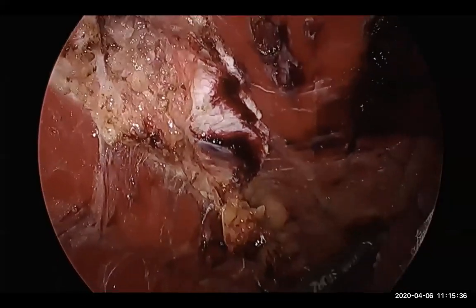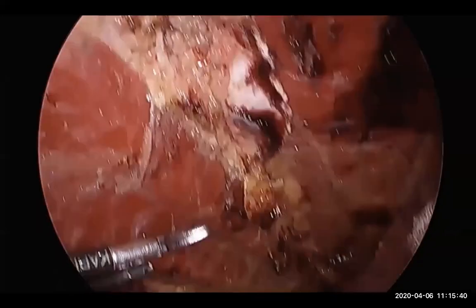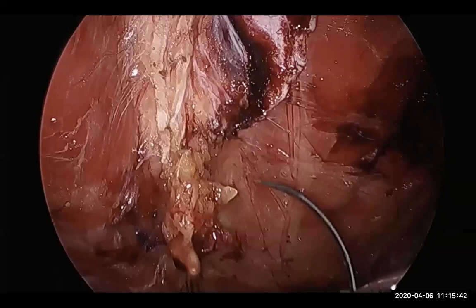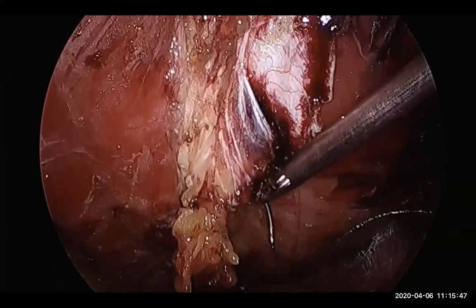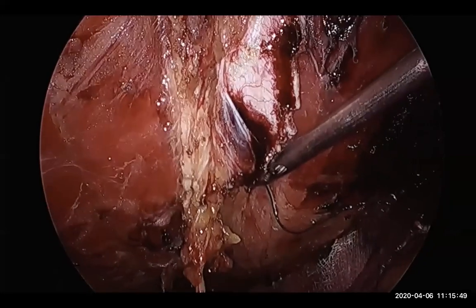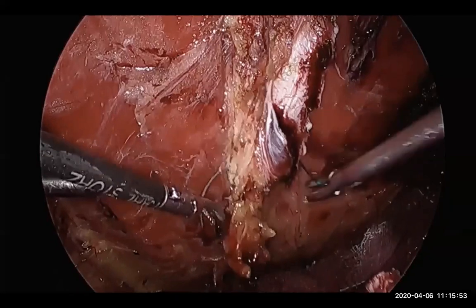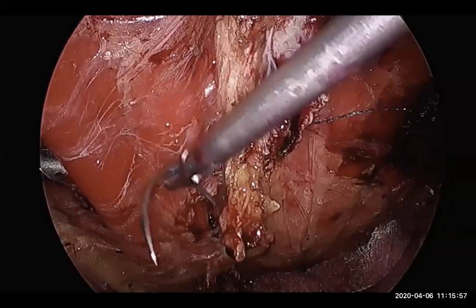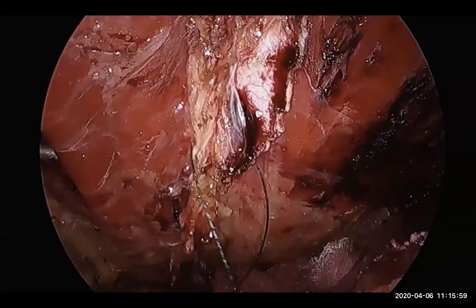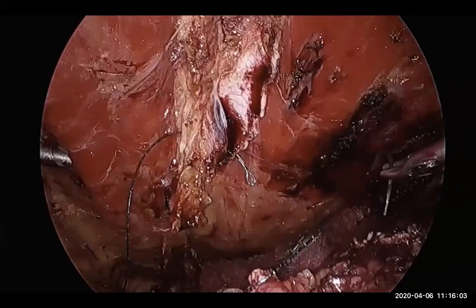Now look at the midline defect, the diastasis, and the linea alba. Now, admittedly, this is a very, very simple case. It's a very small defect. There's not any significant diastasis. I don't recall exactly what was the indication for an eTEP here. Could have been patient choice, could have been something else like part of a workshop or something. Whatever it is, this is a good case, in my opinion, to demonstrate technique.